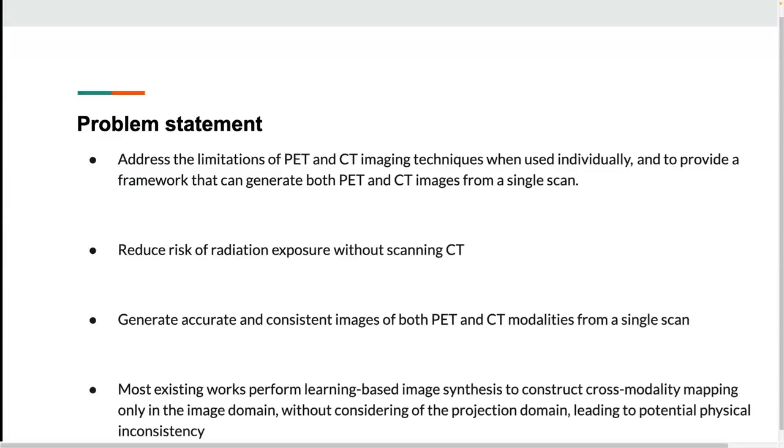The problem statement: to address the limitations of PET and CT imaging techniques when used individually, and to provide a framework that could generate both PET and CT images from a single scan, reducing the risk of radiation exposure without scanning CT. As you may know, CT uses an X-ray scan to generate the image.